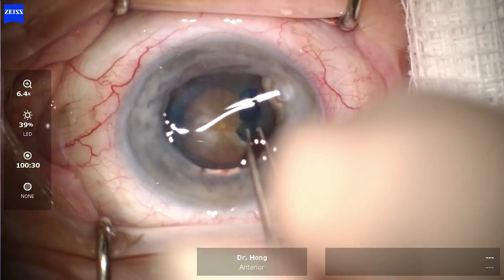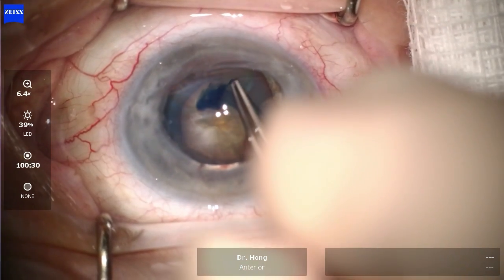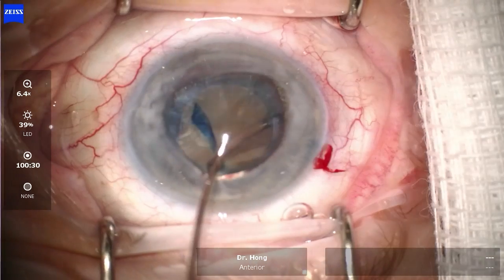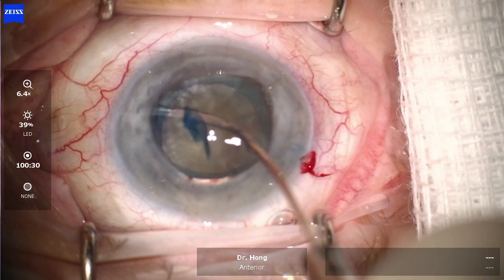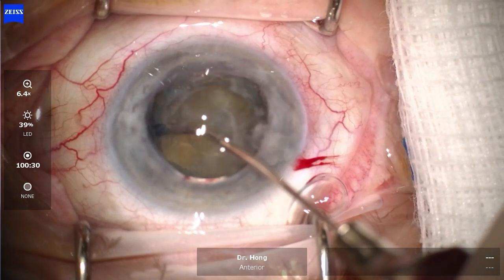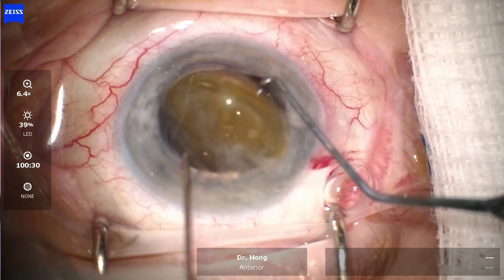Care must be taken not to put any further pressure on the globe, given the risk of an anterior chamber run-out or suprachoroidal hemorrhage. Using balanced salt solution, further hydrodissection was performed, and with a continuous jet of fluid, the rest of the nucleus was then prolapsed.